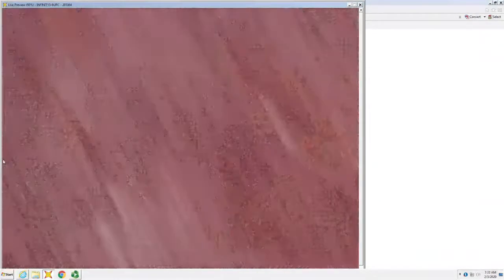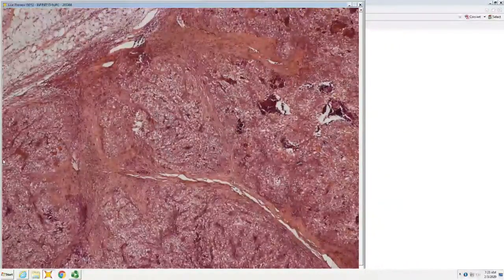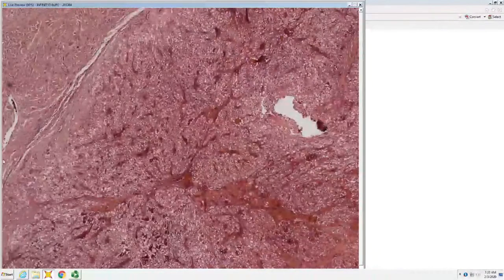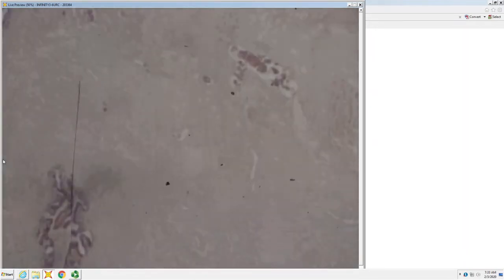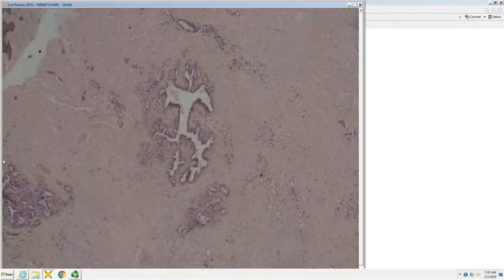Another example of renal. Tubules, clear cells, very bloody. Arborizing vascular pattern, sometimes described as chicken wire-like vascular pattern between those, which tends to go with malignant neoplasm. One of the things that we used to do was get a PAS stain because there's a lot of glycogen in them. Nowadays, that wouldn't be done as often. Probably straight to a renal cell carcinoma antigen marker.